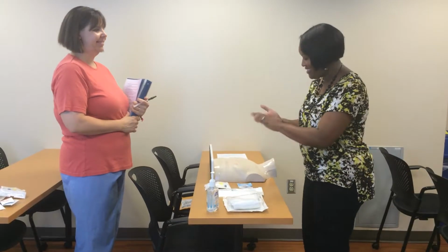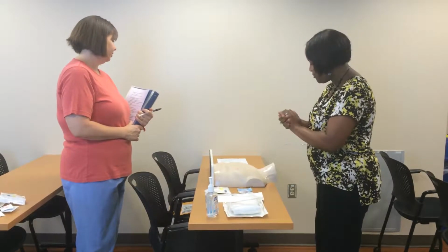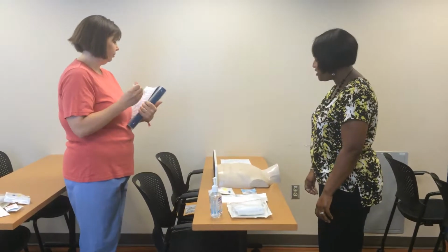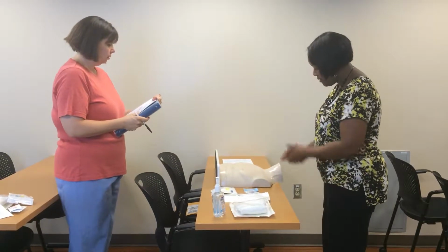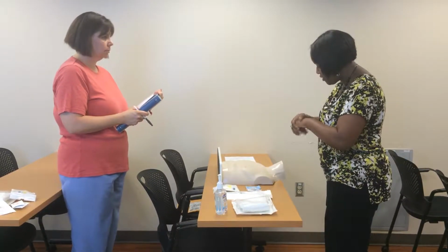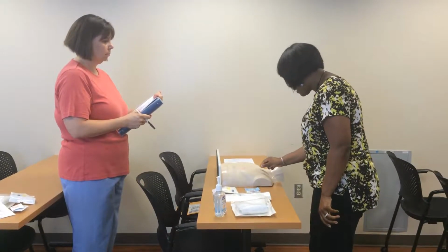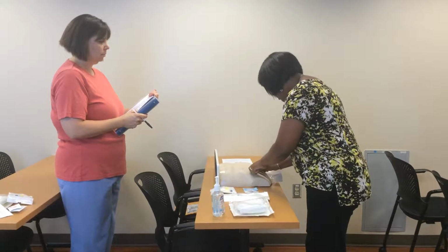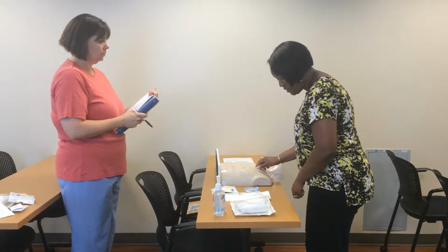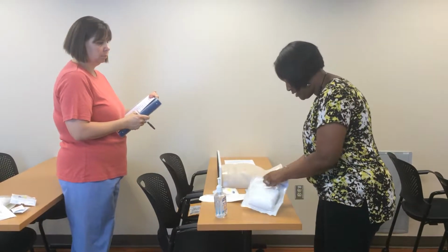Thanks. Wash your hands. Good afternoon, Mr. JG. I'm Ashley and I'm your nurse, and you're here for consolidation treatment, and I'm going to get started with accessing your port. I'm going to just finish washing my hands, and before I actually access the port, I just want to feel to make sure I know where your port is located. Okay. Feel that there. And then we're going to open up the supplies we need.